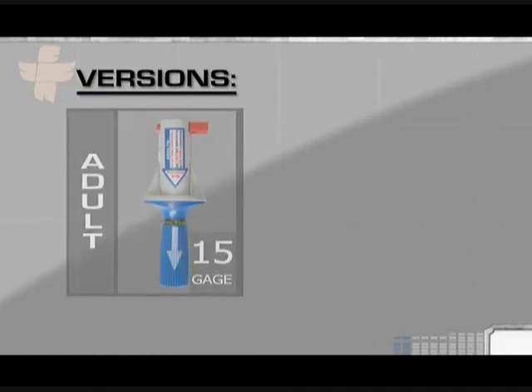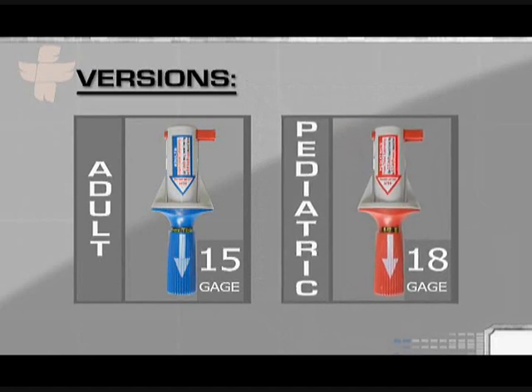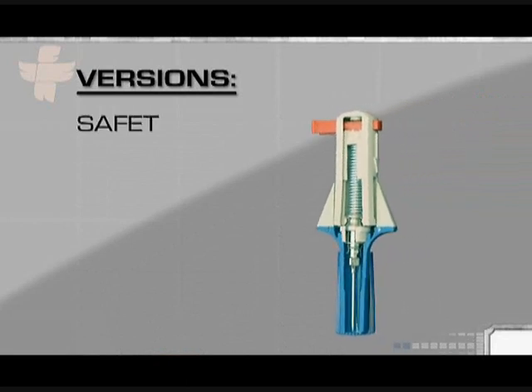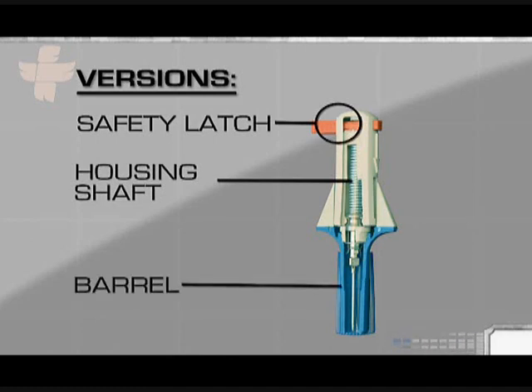There are two versions of the device: a blue adult unit with a 15-gauge needle, and a red pediatric unit with an 18-gauge needle. Regardless of the needle's gauge, both devices have the same basic components: a red safety latch, a shaft that houses the spring, piston, and needle, a red or blue barrel with a directional arrow for correct deployment, and safety wings to ensure proper handling.